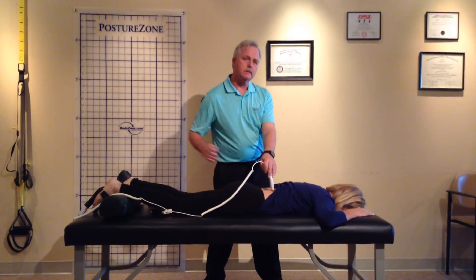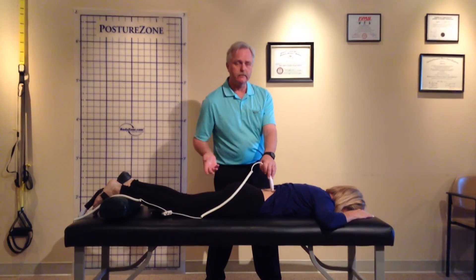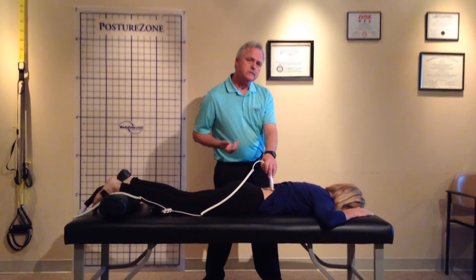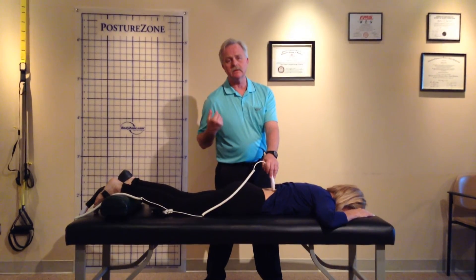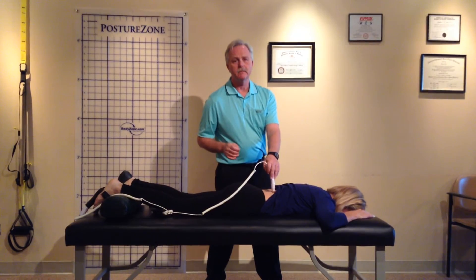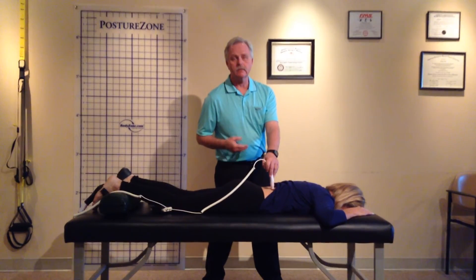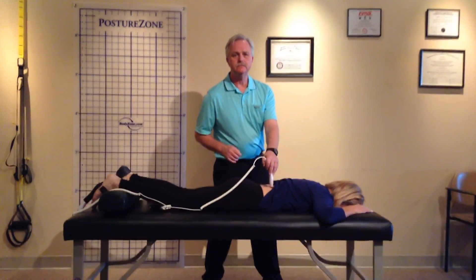This wasn't available with the other unit — you had to be working that area, and it kind of compromised the amount of things you could do during that same time period. I absolutely love the smart laser. The upgrades to it are just brilliant, and it's given me the ability to provide a lot more care in the same period of time. I absolutely love both lasers, but this one has really enhanced the quality of care in that same time period. Absolutely love it. Thank you.